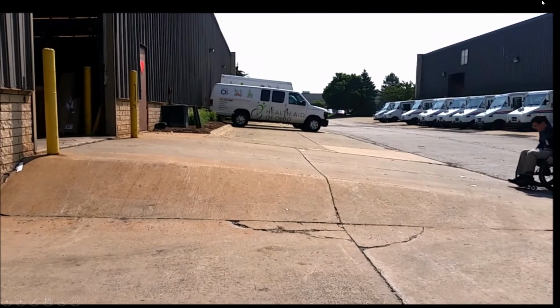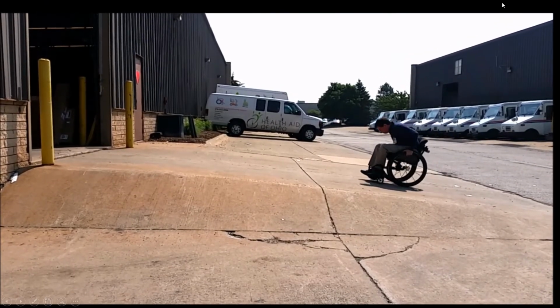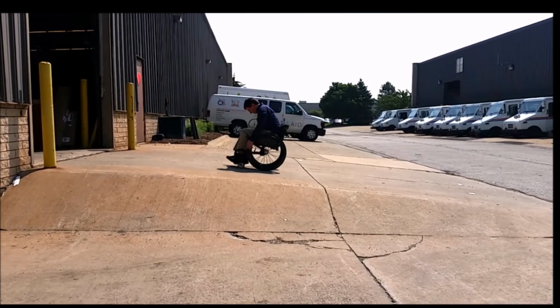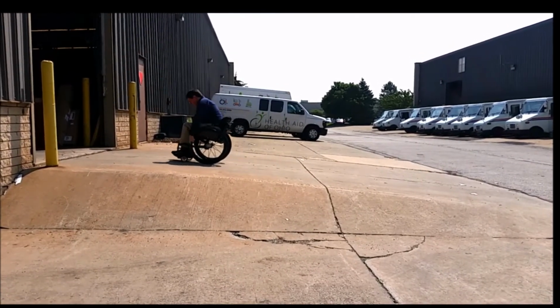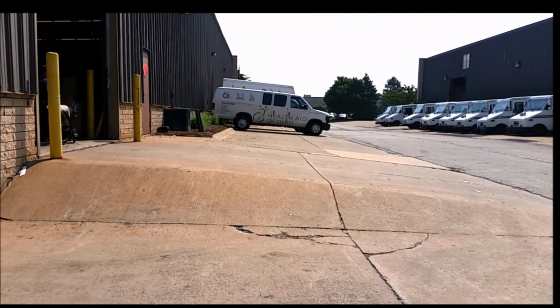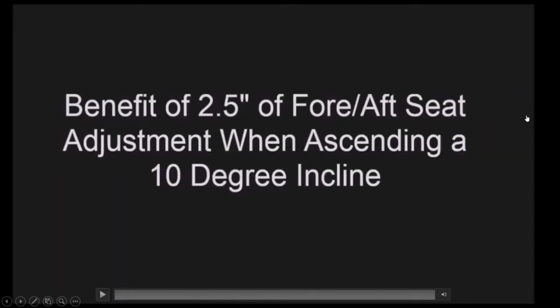So what effectively moved, aside from him moving the chair, was the blue dot in his diagram of center of mass. It's something you can't get from specs and something you can't get from a CAD, but you can visualize where somebody's center of mass is and effectively moved his center of mass forward, put enough weight on the casters that he could get up the slope.